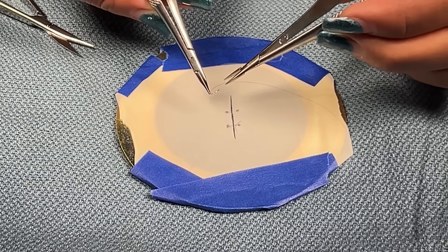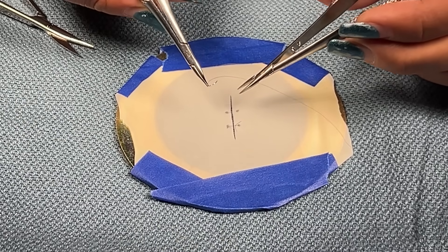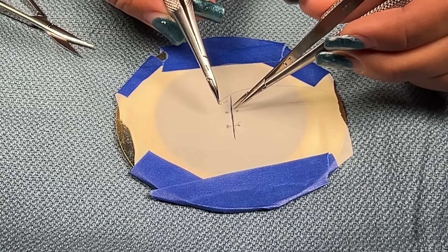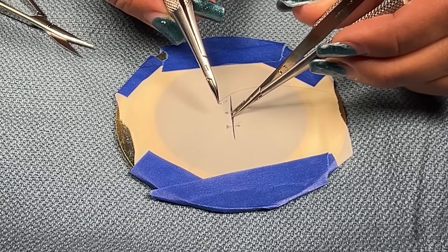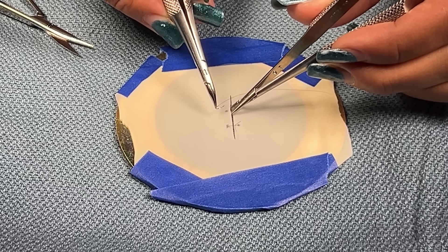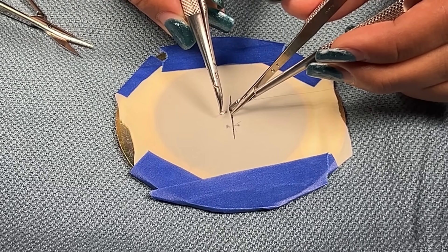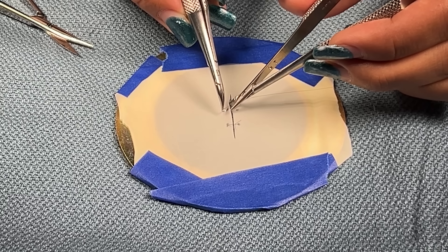Once I have that stabilized, using my forceps, I'm going to go under the near flap and stabilize. I'm going to stabilize that as I counterpressure and drive my needle through.